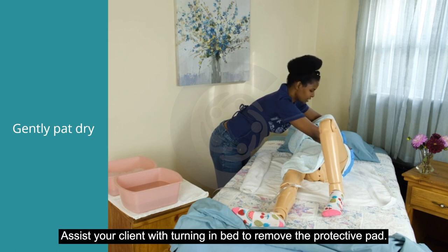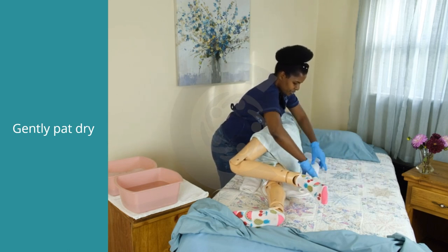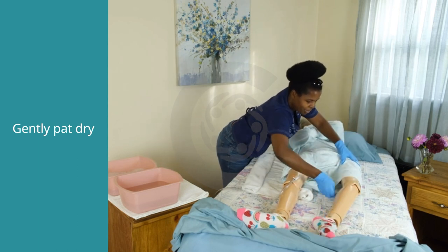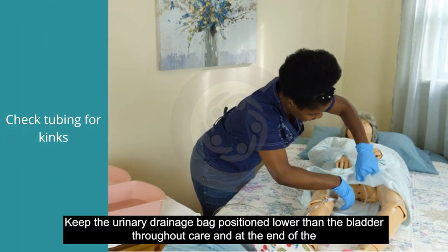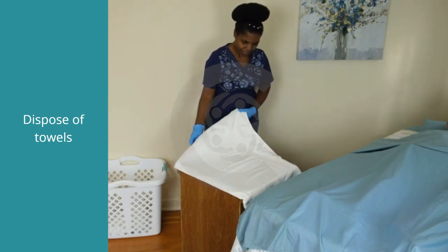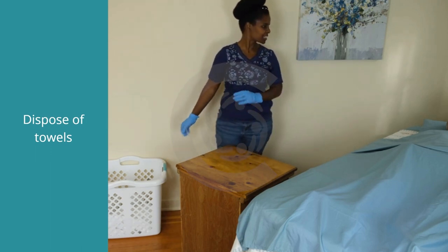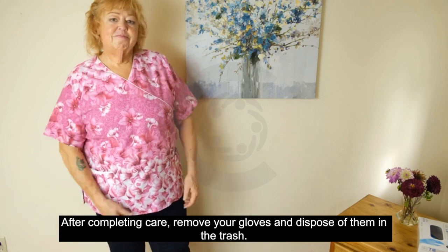Assist your client with turning in bed to remove the protective pad. Keep the urinary drainage bag positioned lower than the bladder throughout care and at the end of the procedure. Make sure there are no kinks in the catheter tubing. Dispose of the towel and other items in proper containers. Leave your client covered with the top sheet at the end of care. After completing care, remove your gloves and dispose of them in the trash, then wash your hands.